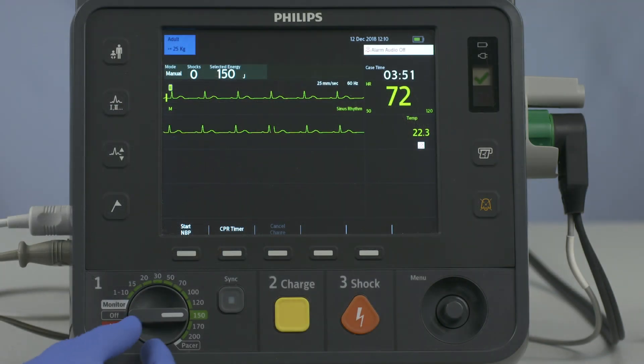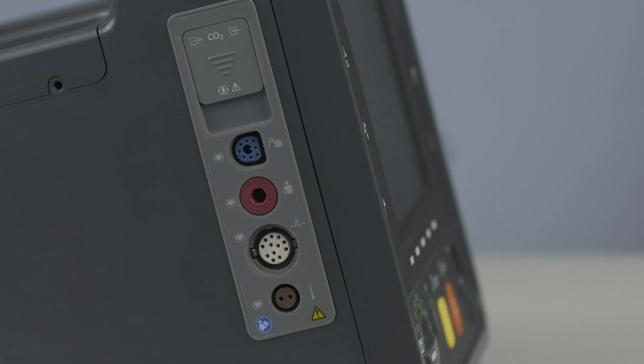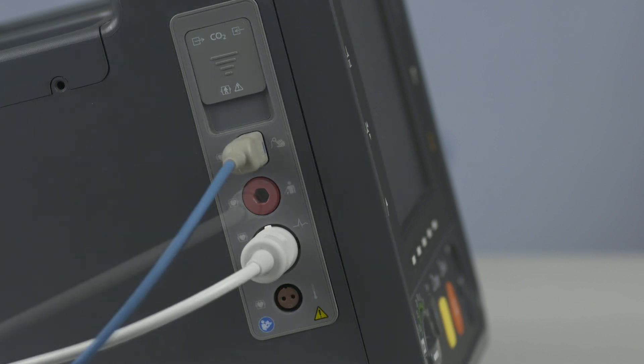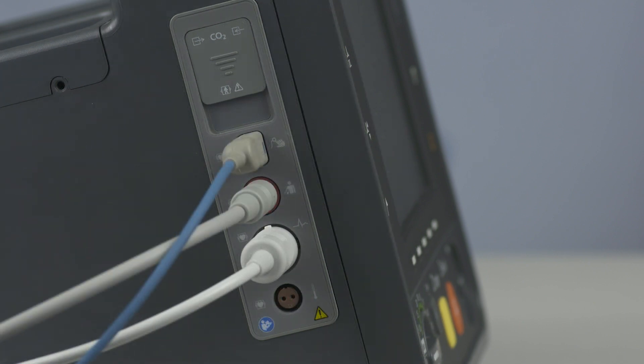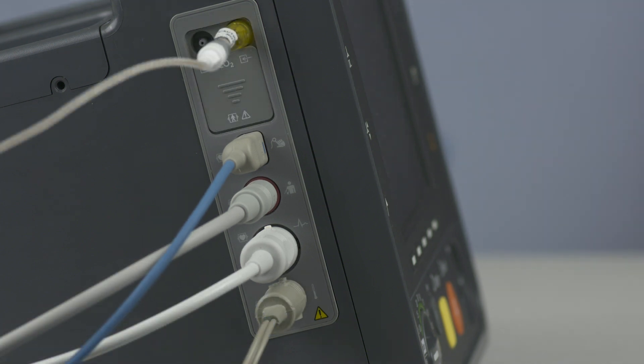The HeartStart Intrepid connections and controls are carefully organized to facilitate ease of use. Color-coded ports for monitoring cable connections are on the left: ECG, SPO2, non-invasive blood pressure, temperature, and CO2 cables plug in here.